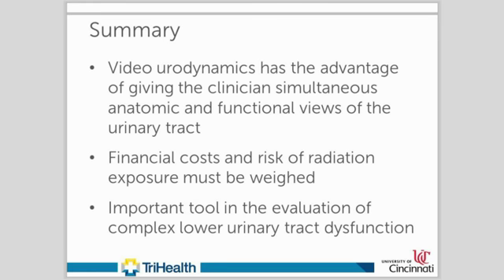Video urodynamics has several important advantages over conventional urodynamics for the evaluation of patients with lower urinary tract symptoms. It gives the clinician simultaneous functional and anatomic views of the lower urinary tract. While this can be of great benefit for specific patient presentations, the advantages do not come without potential risk. Financial costs and risk of radiation exposure must be weighed against the benefit. Nevertheless, in complicated patients, as illustrated here, video urodynamics may be invaluable in evaluating complex lower urinary tract dysfunction.